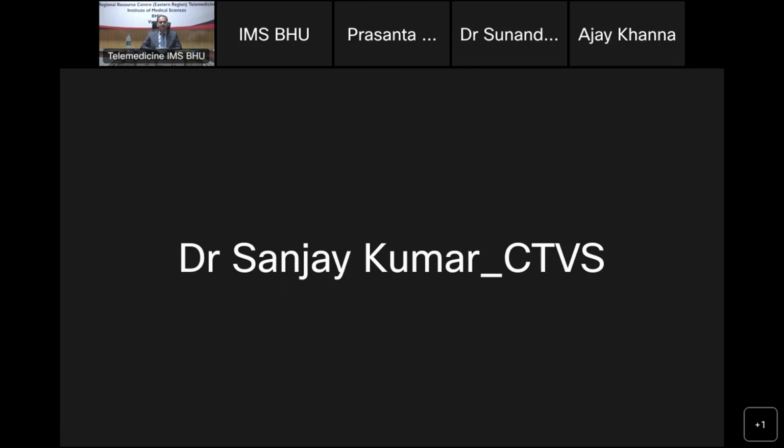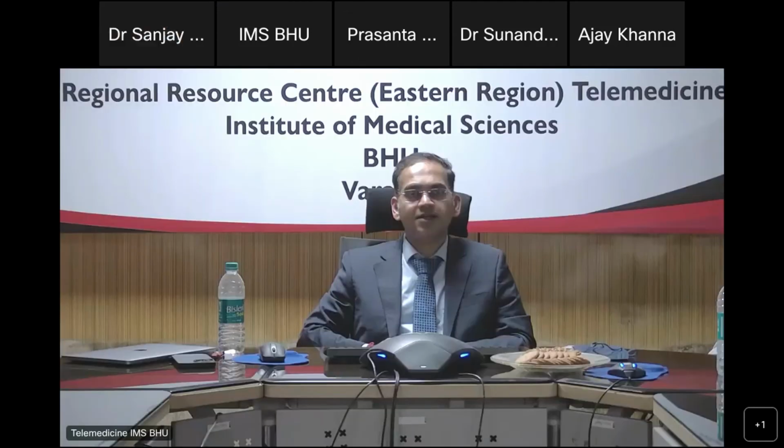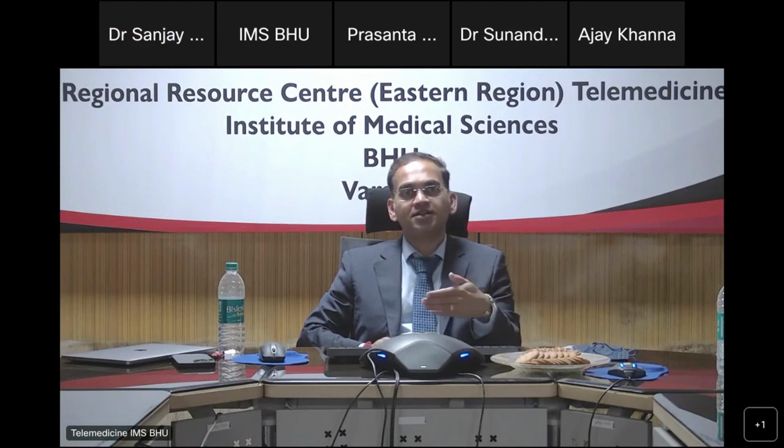Dr. Kumar, I think that's a really good clinical point that you made just now. What would have definitely helped is a dedicated cardiac CT. Anytime there is a question about an LVOT lesion, we recommend not doing a single phase CTA, but rather relying on a multi-phase acquisition throughout the cardiac cycle that allows us to look at the LVOT area in both systole as well as diastole.